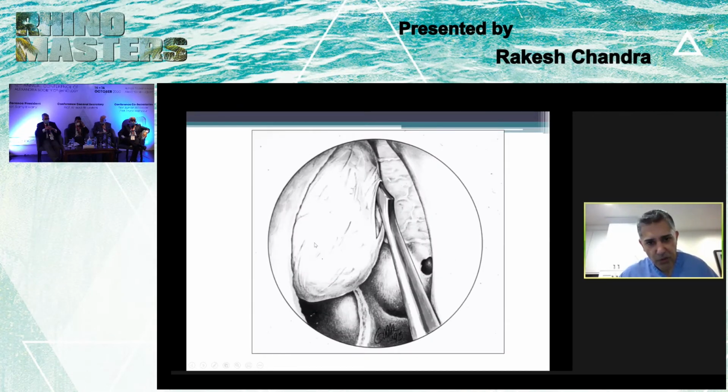Then, I like to use an arachnoid knife for this, we make incisions in the periorbita. Sometimes, depending on the patient's anatomy and where the septum and middle turbinate might be, it's more convenient to make these incisions vertically. Sometimes making them horizontally this way is better. Realistically, despite what's shown in this diagram, I like to make them horizontally if possible, because that way I'm making them parallel to the medial rectus muscle, which is usually deep to the fat layer by a fair amount, but sometimes it can be a little more superficial, and you don't want to injure that by cutting perpendicular to it.